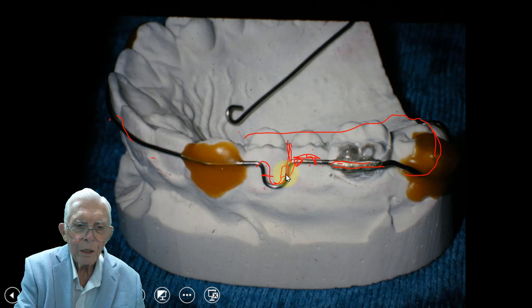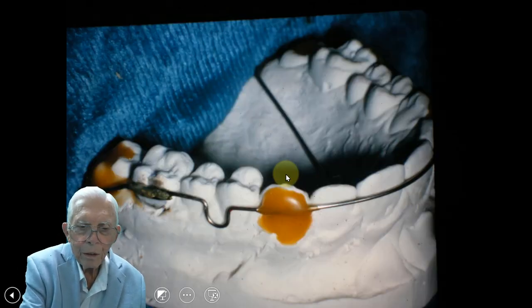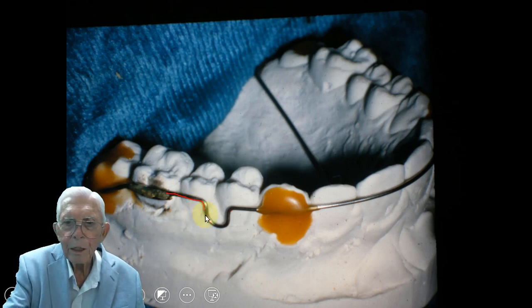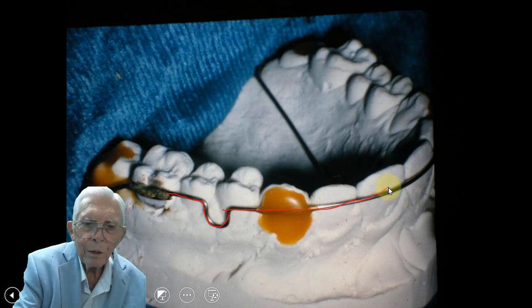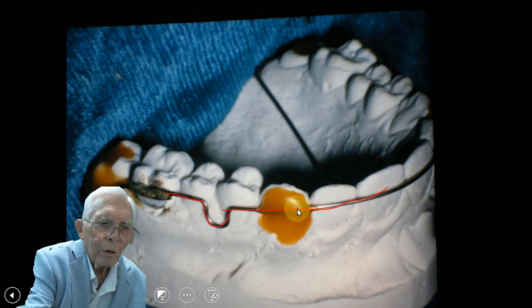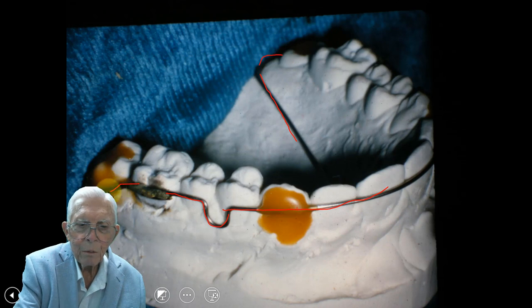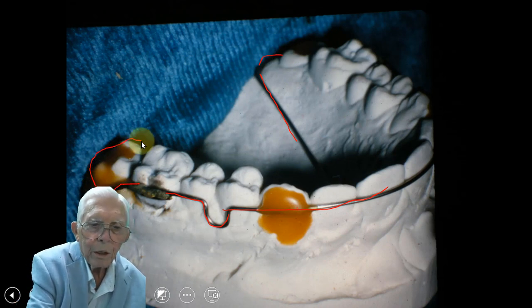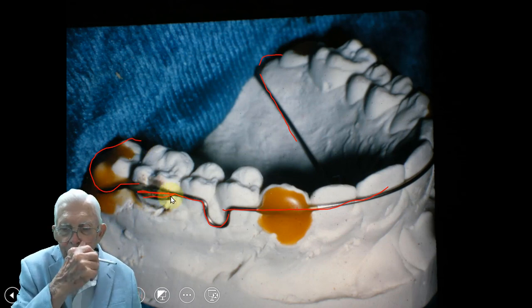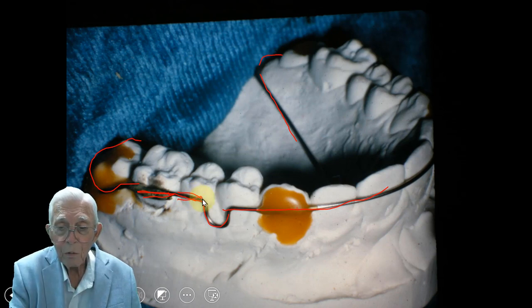We make the retainer with three different wires — one coming from this side, put it around, and then sticky wax it. When we come out with the heavy wire, it has to work around the back of that tooth, and sticky wax it in place. This is a solder joint — you put it either there or you can put it up closer to the front if you want. You can put this wherever you want.